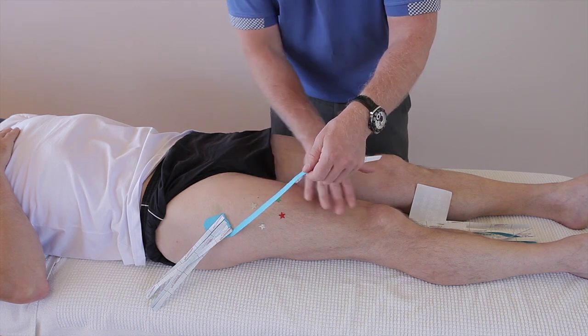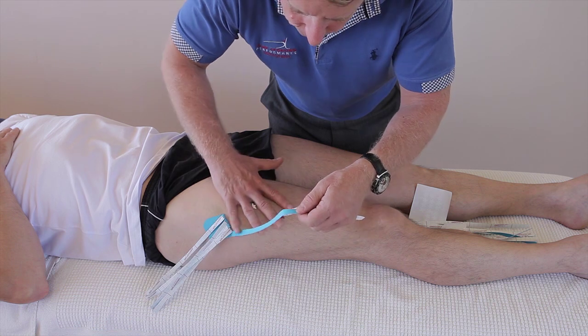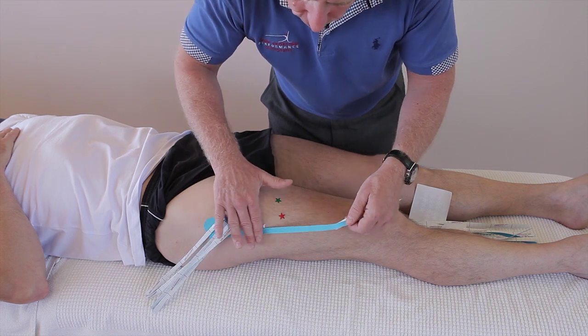Little to no stretch — no stretch on the quad and no stretch on the tape. So let's say there's swelling in this area; we're just going to cross that.